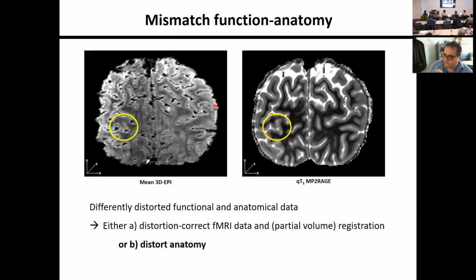So even though at first glance it looked like the registration between these two images was good, when we would get the gray matter information from here, where the gray matter is, would overlay on this one, we would be not segmenting the functional images well. And which then means all the laminar fMRI analysis based on these images would be wrong. So we would get, say, superficial changes, even though in reality it might be deep layers might have changed.